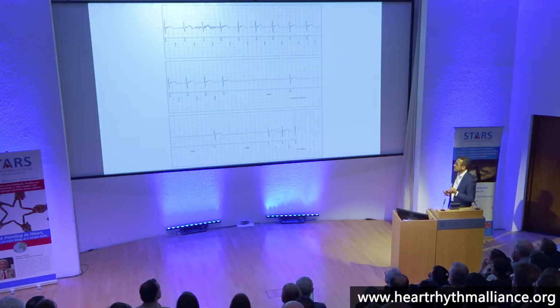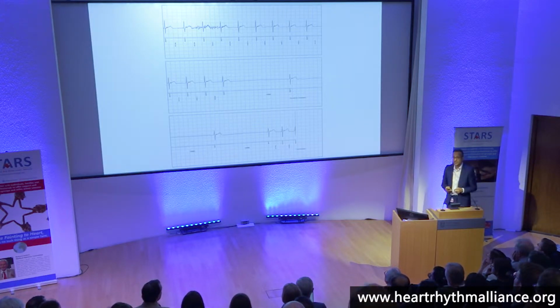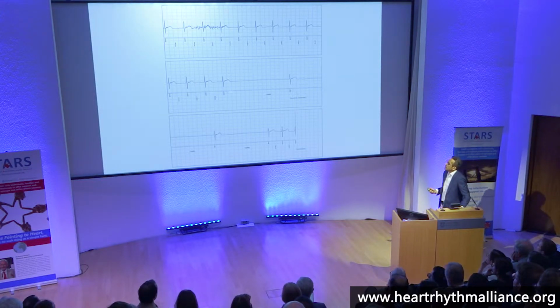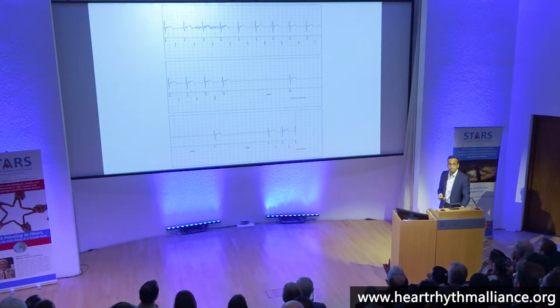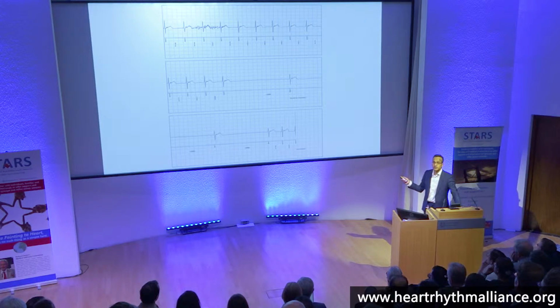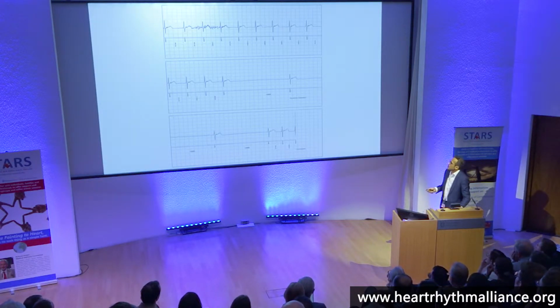No? Okay, same patient. What are we seeing here? You're seeing P waves marching through, absence of QRS, quite long pauses. Who'd pace this chap now? Okay, so I lied to you. This wasn't a 66-year-old minicab driver. This is a 32-year-old GP in a busy inner-city practice. Who'd pace him now? Okay, two or three. So we didn't pace him.